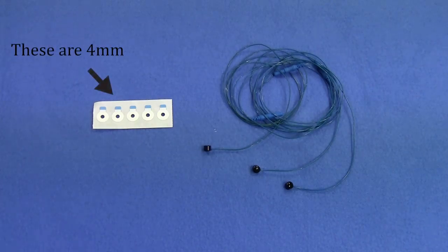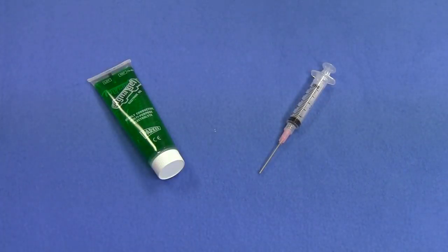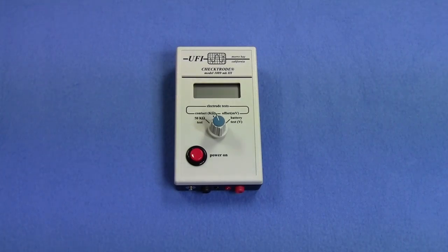If you have multiple sizes of reusable electrodes at your lab, ensure the correct size is present. Conductive gel and syringes for filling the reusable electrode caps with the gel. Again, be sure to check the expiration date. And finally, a meter for checking contact impedance at the skin-electrode interface.